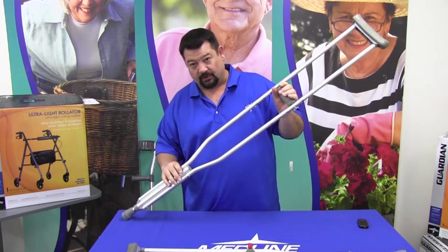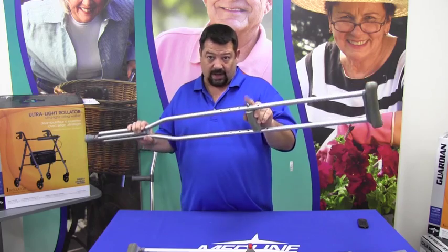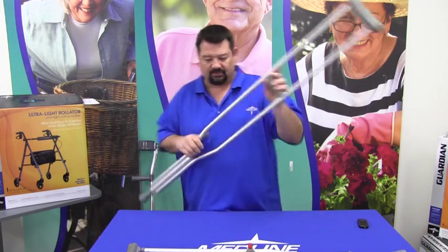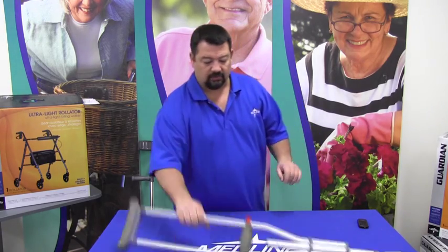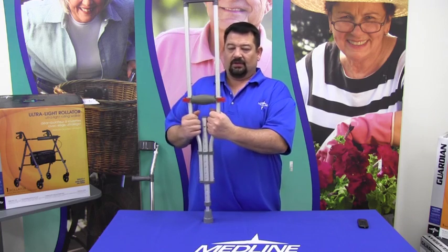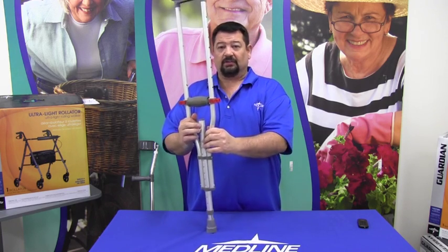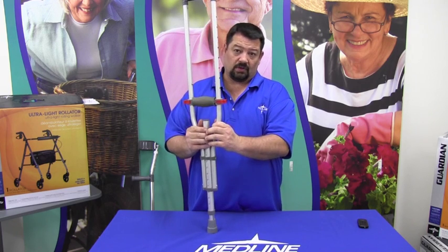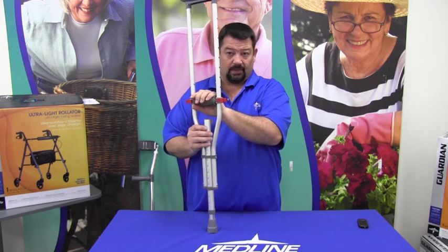Now, not all axillary crutches have a wing nut here. Not all of them have a push button here, but the vast majority do. If they don't have this wing nut, one of the options is this universal style. Okay, the universal style does many, many things. Even though this looks to be a small crutch, this is actually good for somebody over 6 feet tall. And they do that by having multiple layers of adjustability.